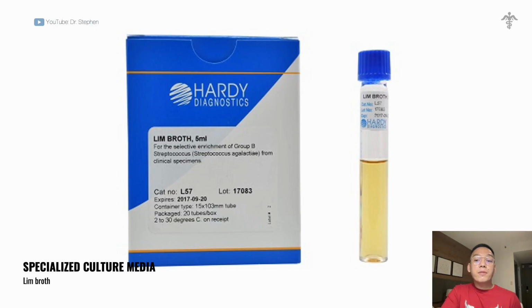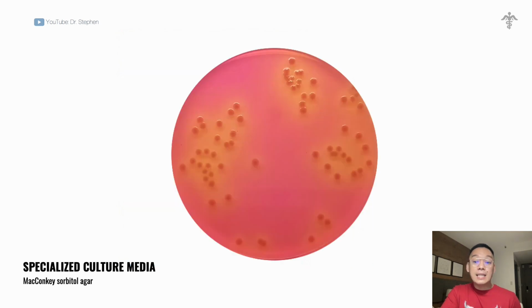Lim broth is for the selective enrichment of your group B streptococcus, such as your Streptococcus agalactiae from your clinical specimens. Lim broth is highly selective or specialized for the recovery of your Streptococcus agalactiae. MacConkey sorbitol agar. This is also specialized for the recovery of your Escherichia coli strain O157.